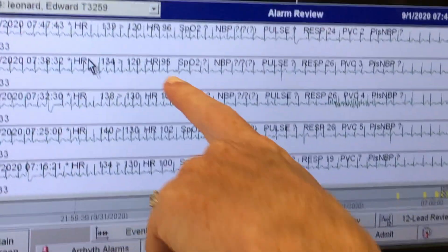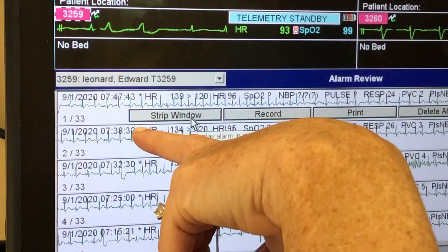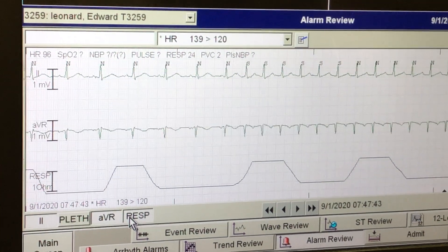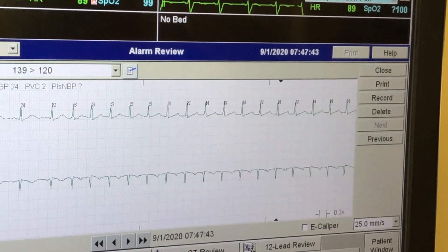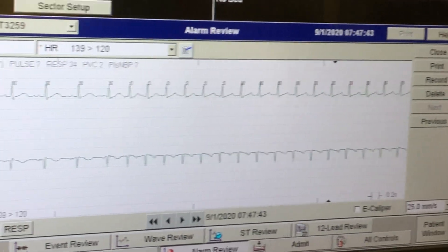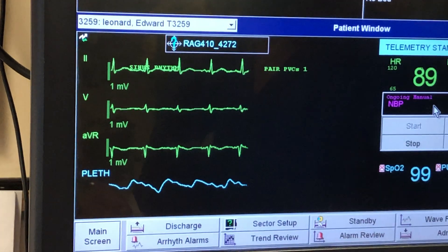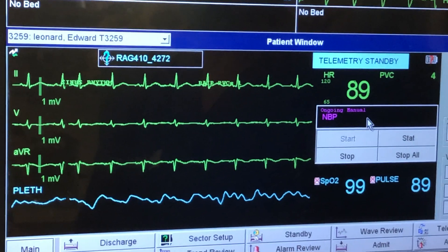You can also go to alarm review, and this will tell you when an alarm went off. Even a yellow alarm — you can go back and look at anything. Just looking at this person, it looks like they're in sinus rhythm, but obviously they're having some irregular beats.